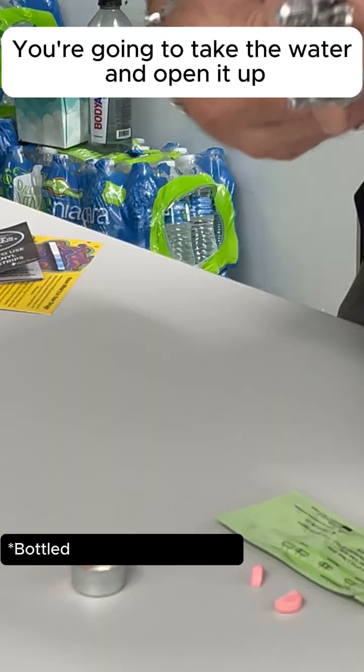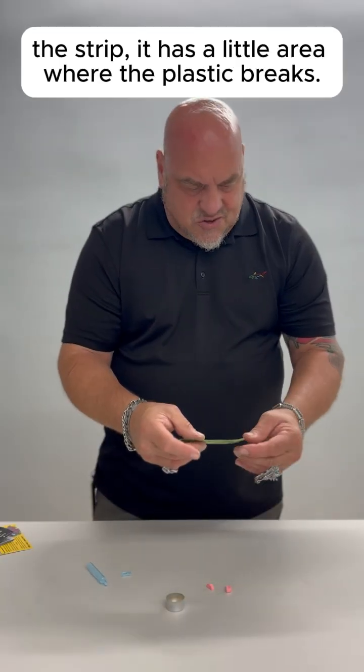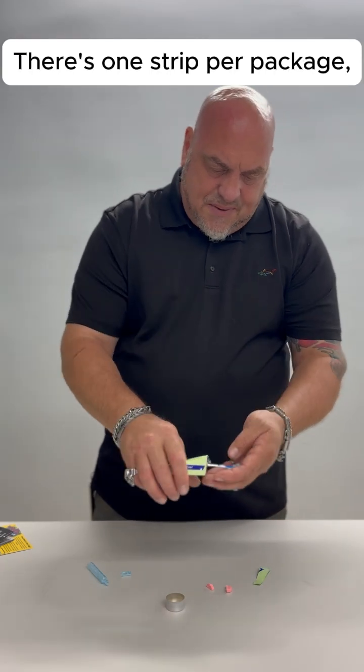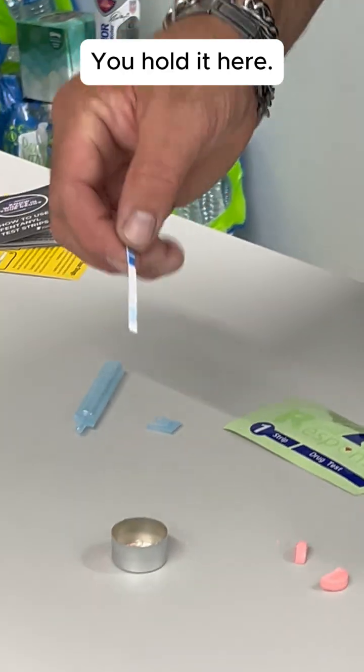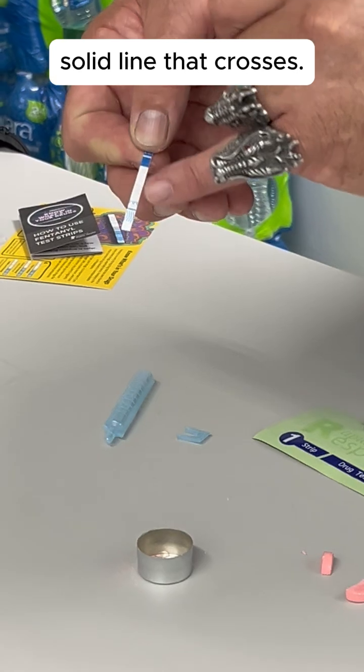You're going to take the water, open it up, and put it into the cooker. When you open up the strip, it has a little area where the plastic breaks — you open it. There's one strip per package and it's going to look like this. You hold it here. It has squiggly lines on the other side and a light solid line that crosses.